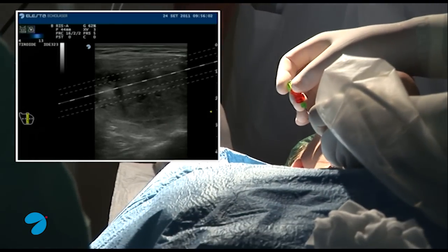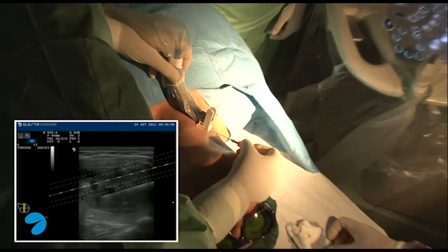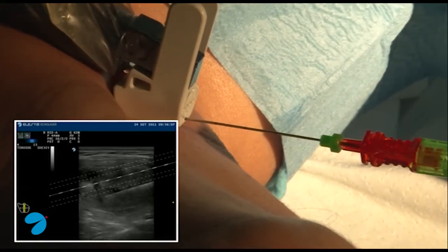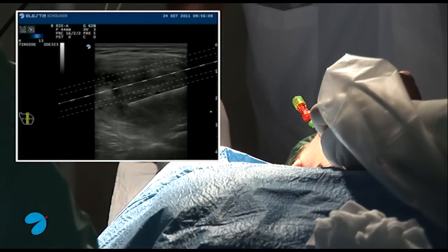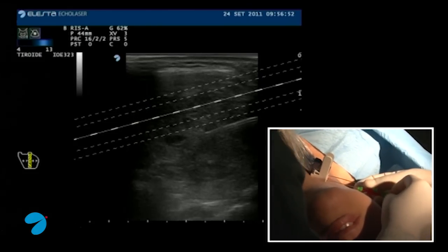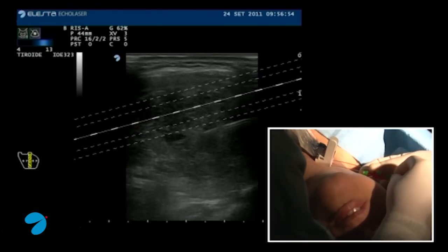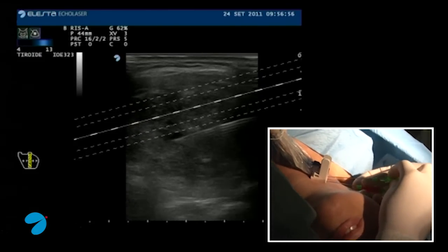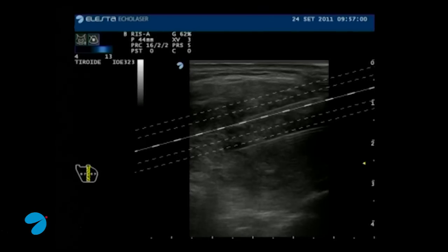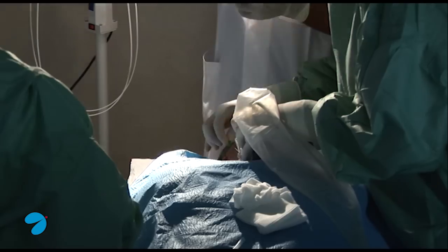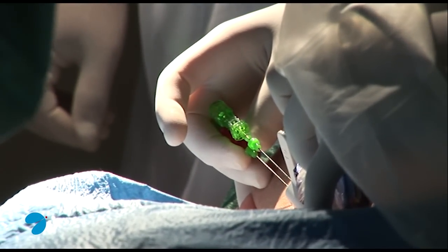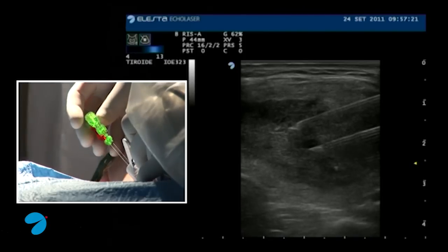In this case, we can see the insertion of the first needle that follows the last line of the guide system, and the insertion of the second needle that follows the third line of the same guide. We have the possibility to use five guidelines. It's important to place needles at an appropriate distance from vital structures like trachea and vessels.